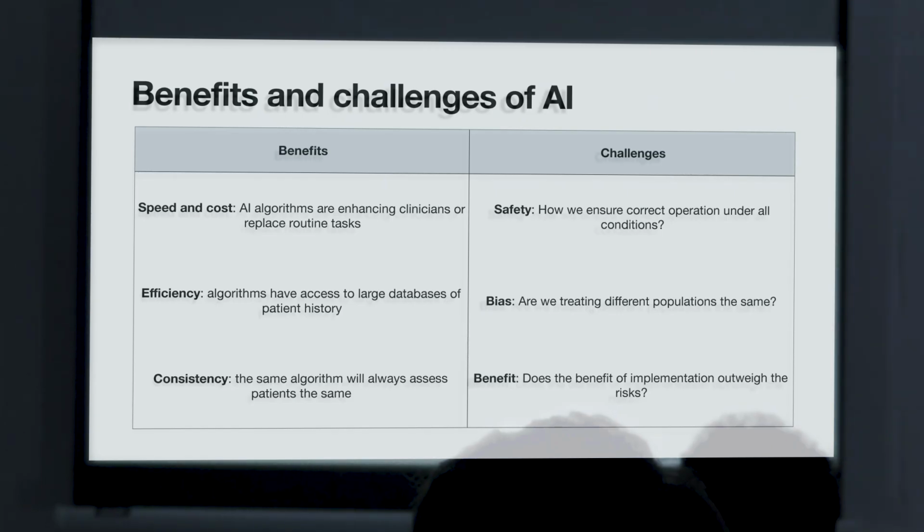Well, of course, the first challenge is safety. We want to show that there are no problems, no caveats to the algorithm, that it operates well under any possible scenario. We want to address bias that potentially arises in the algorithm naturally. A common example might be skin color, and we actually do see sometimes in our video analysis that skin color could be affecting model performance.